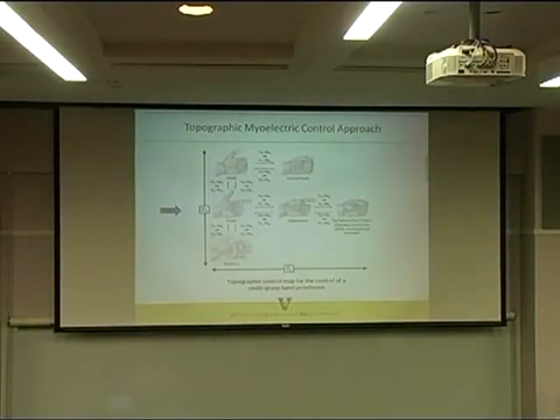And we use those signals to, this seems kind of strange, drive the hand around a map. The reason we do that is because we can get to any hand position with just one of those 4 signals. We just need a directional signal here and a directional signal here. So it's a way of breaking up the complex function of the hand into a much more simple, fairly simple map.